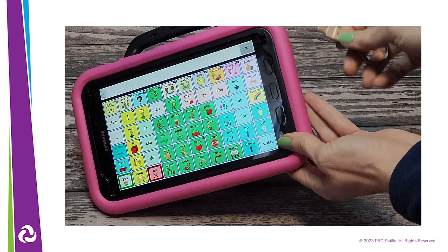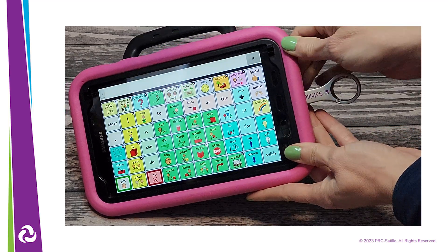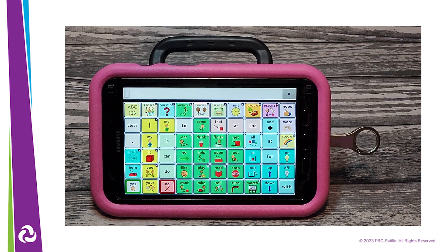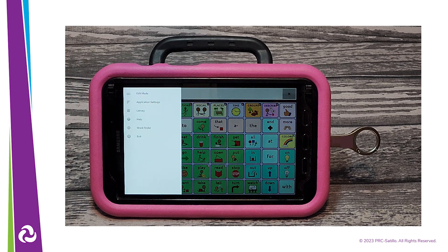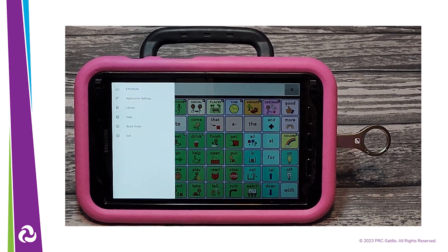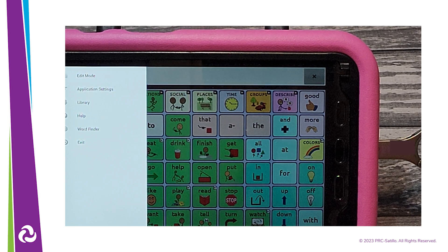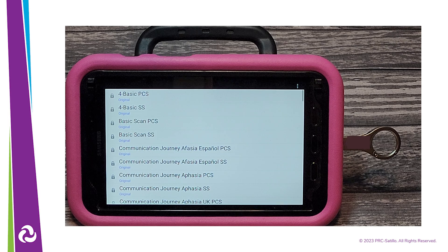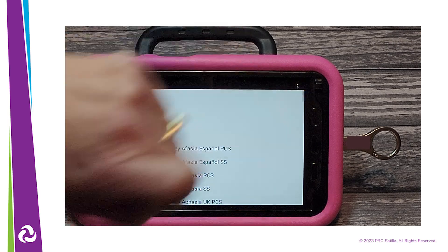Locate the charge port on the side of your NovoChat device and insert the dual USB into the port. Next, tap on the menu. Find Library on the list and tap on it. Find the three gray dots in the upper right corner and tap them.